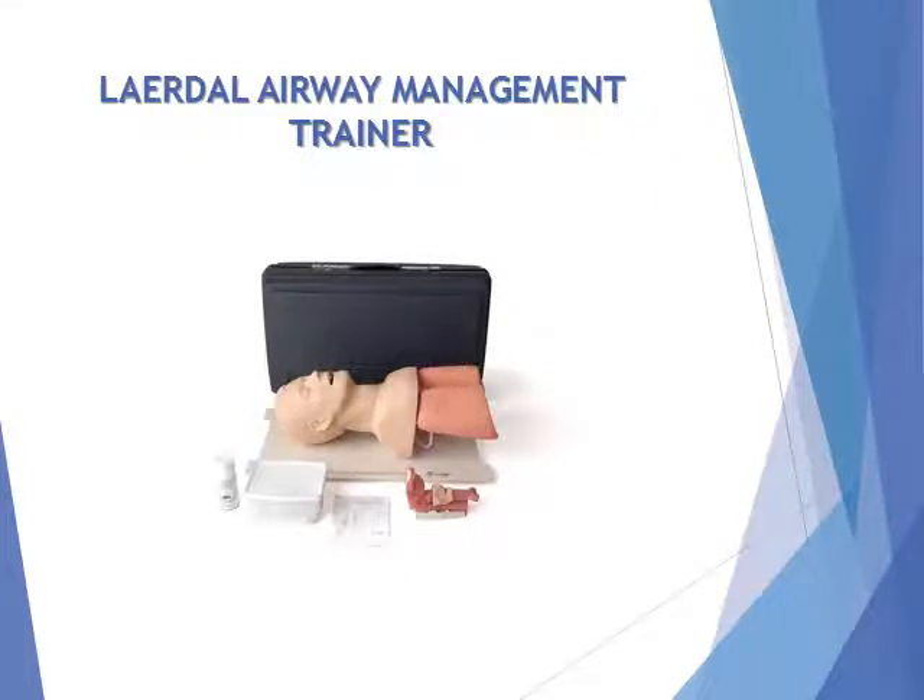Layerdal Airway Management Trainer. Realistic practice is the key to developing proficiency in airway management skills. The Layerdal Airway Management Trainer's lifelike operative zone and head simulates real-world complications when practicing a variety of intubation, ventilation, and suction techniques.